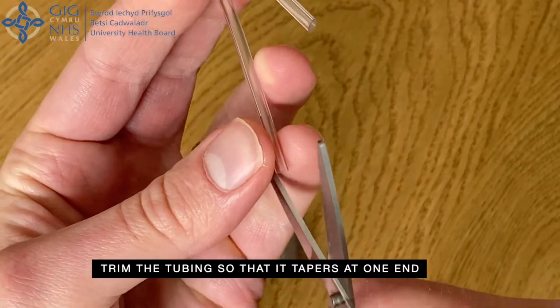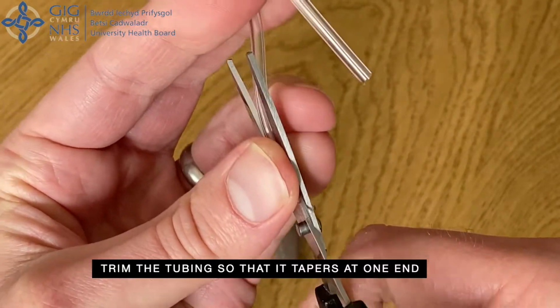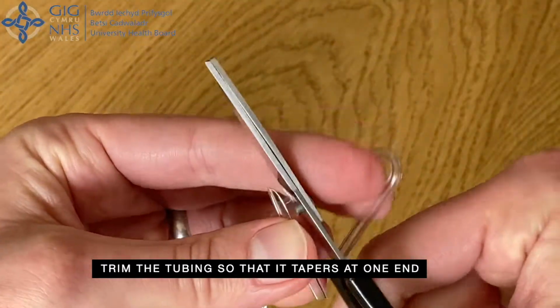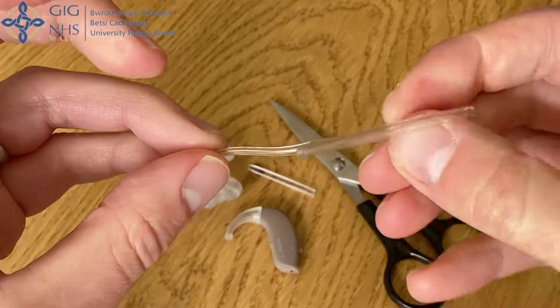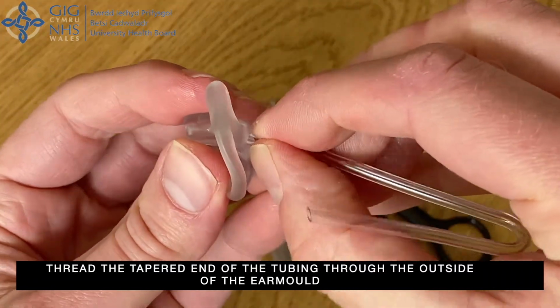Use scissors to trim the new tubing so that it tapers at one end. Thread the tapered end of the tubing through the outside of the ear mould.